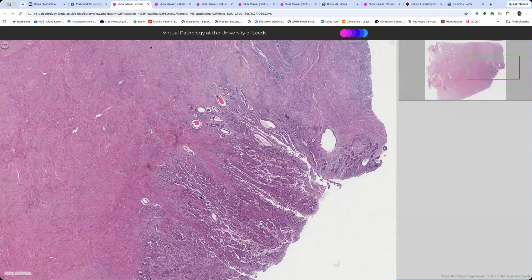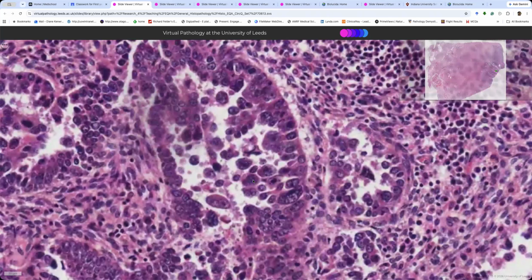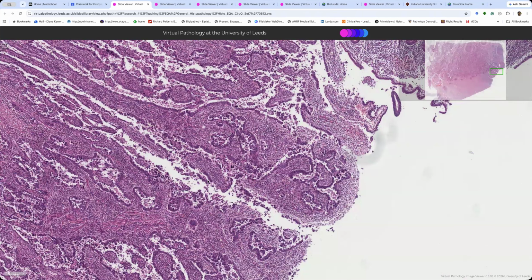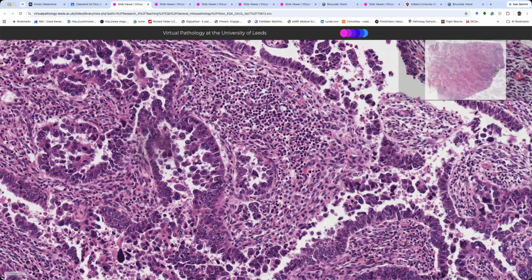Because if you're going, oh, it's endometrioid, there's lots of glands, it's grade 1, and then we go, oh, that's terrible. Look at them. They're awful. So glands out of keeping with the atypia and long, thin glands, right? But you're telling me, aren't they meant to have papillae? Where are all the papillae? Well, the papillae can be a bit subtle, all right? So here we've got the hobnailing and we've got these unsupported papillae poking into these glands.